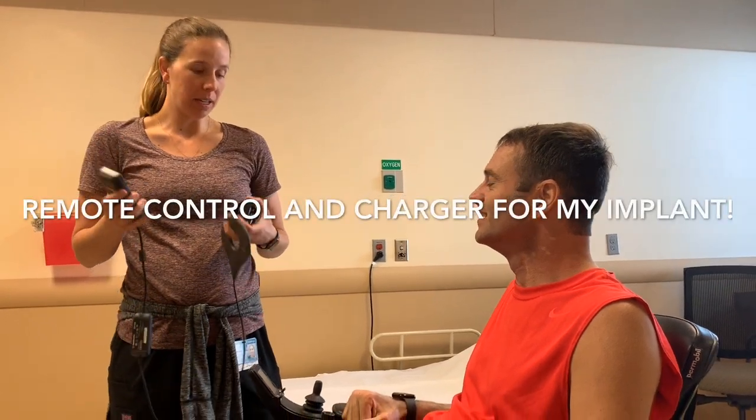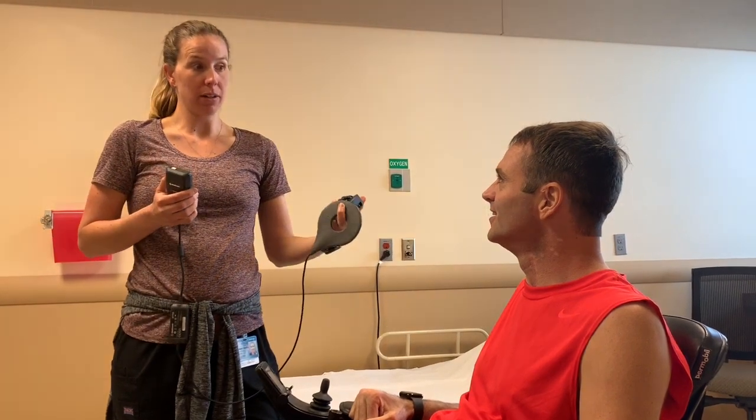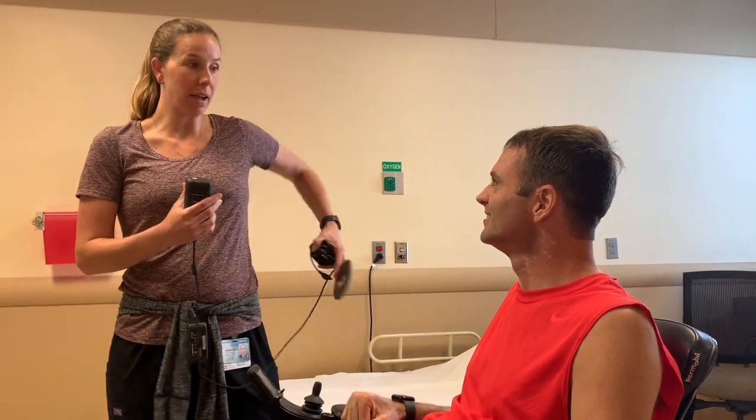Don't ask for date and time and that kind of thing. But this is how you charge your internal battery. So you have to set this up against the battery pack. Okay. And it will charge. And it will show you on the screen that it's connected? Yes. Gotcha.